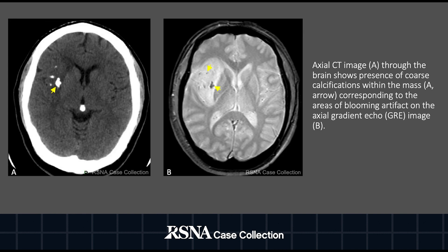There were associated calcifications within the mass depicted by the yellow arrow on CT to your left, corresponding to the areas of bloom artifact on the gradient echo image to your right.